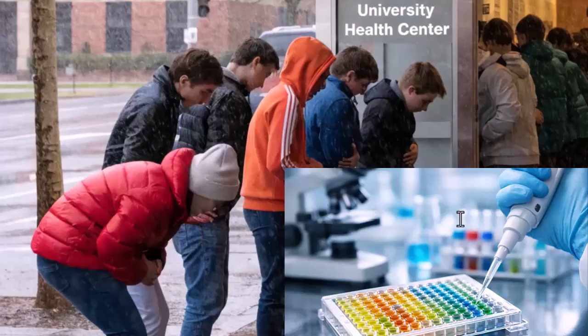In the cafeteria outbreak scenario, why might a toxin ELISA give a false negative even if a toxin is present? Possible reasons: matrix effect from creamy dressing or other food component interfering with antibody binding, or using an ELISA kit designed for a different toxin than the one actually present.